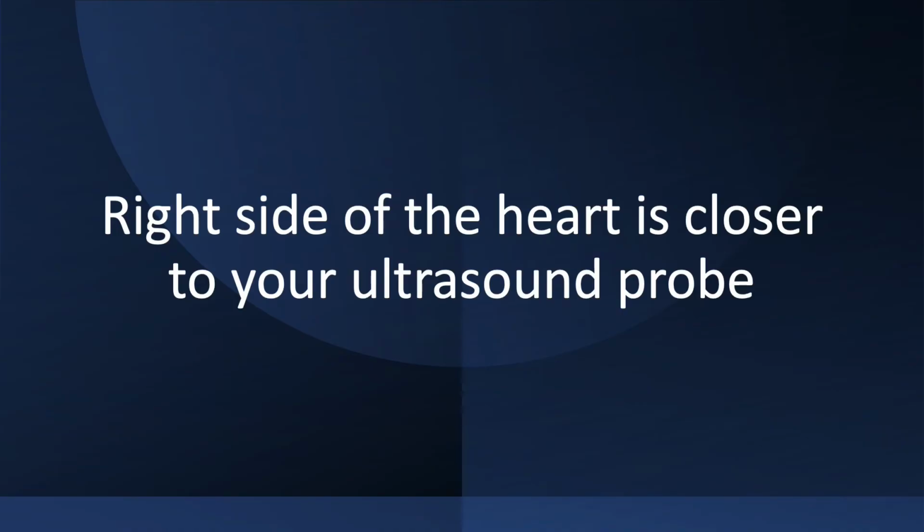If you get confused about the orientation, remember the right side of the heart is more anterior, which means it's going to be closer to your ultrasound probe.